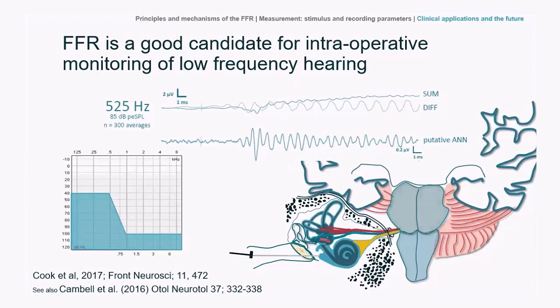A basic criteria is shown with this audiogram on the left, where someone might have even mild to moderate sensitivity levels in the low frequency region, and this leads to a desire to monitor in real time, or as close to real time as possible, during an implantation phase to address a high frequency loss, the integrity of the low frequency hearing, of course with the intention ideally of hearing preservation for that lower frequency acoustical sensitivity.